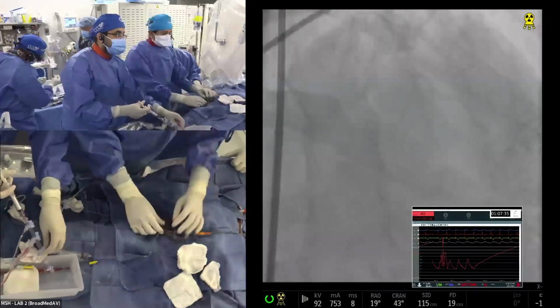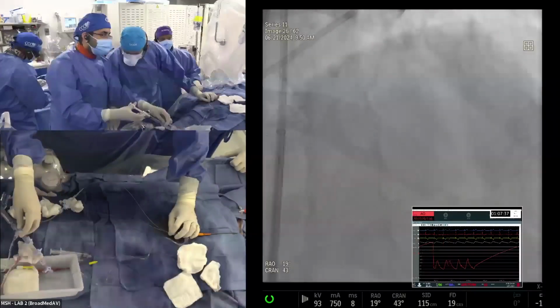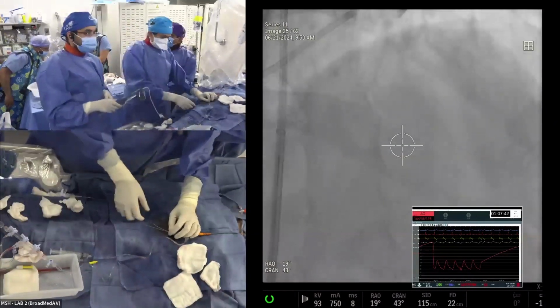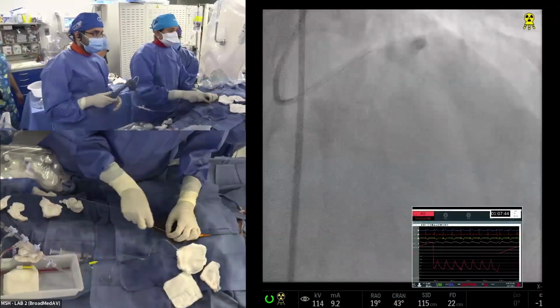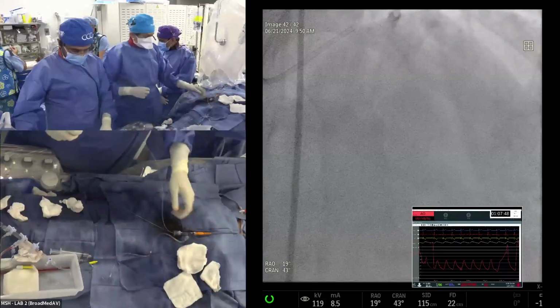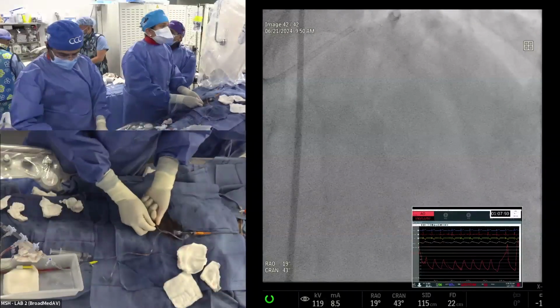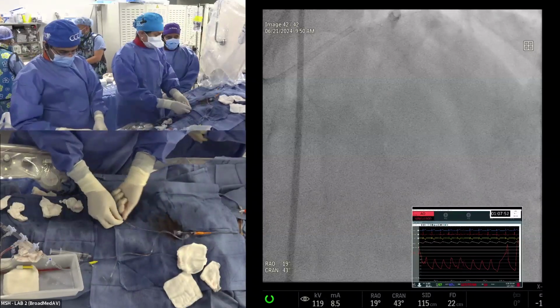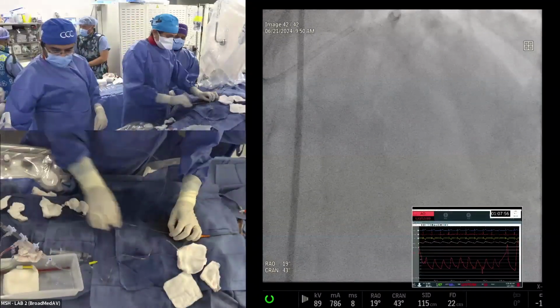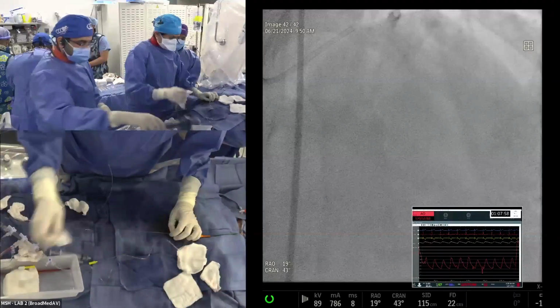Very good. Dissection is normal. The balloon artery ratio is 1:1? Actually, we go a little minus. Our teaching has been good. Both can come out. If you want to put a wire there, you can go to rota. So our goal has always been to slightly undersize the cutting balloon for the main vessel. If it is ISR, then you go to 1:1 or maybe even slightly 1+.